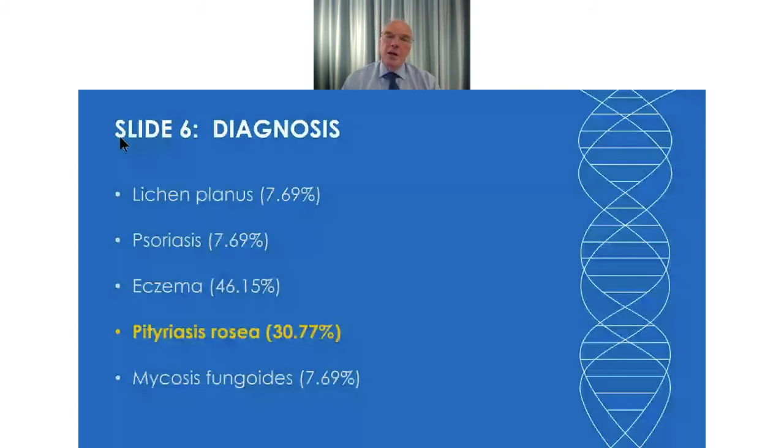So this is a clinico-pathological diagnosis. You need to know what the patient looks like, what the dermatologist thought about the patient before reaching a final diagnosis. It was a bit acanthotic, but I would hesitate to support a diagnosis of psoriasis because it wasn't showing the other features of psoriasis, which can be quite variable, sometimes quite subtle.